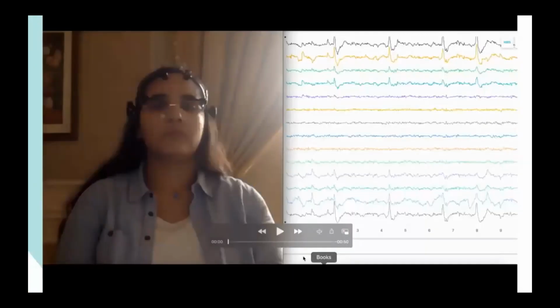As we mentioned in our previous presentation, the headset arrived really late, so we only used it to read signals. If we had more time, we would have been able to gather more data and use it to fine-tune the model according to the headset data, then use it for testing. However, we made sure that the electrodes we chose for scouting in the model are the ones available in the headset. The following video is a demonstration of reading the signals in real time.